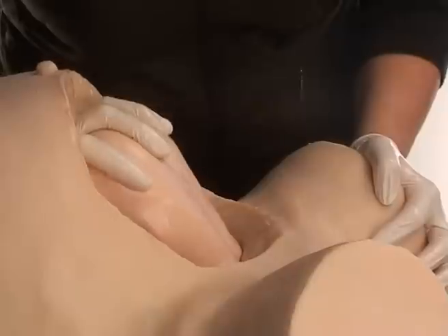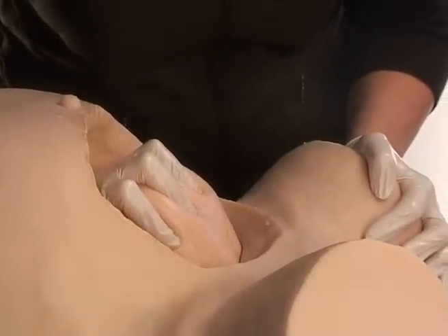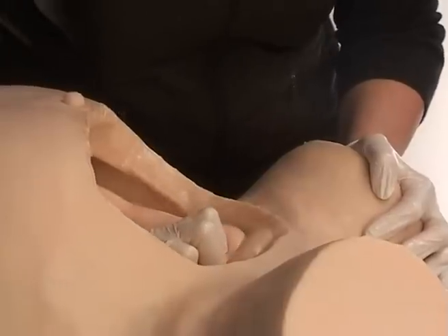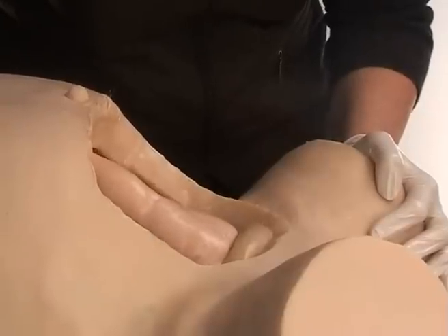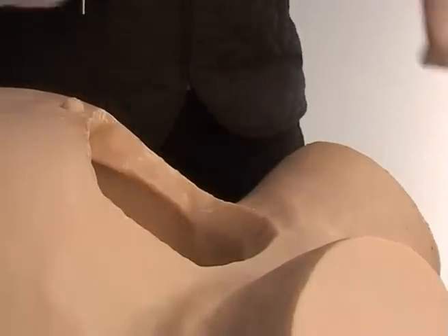Again in a side view, look at how high the buttocks are lifted up and the angle at which Sophie is pushed down into the birth canal. This is the fundamental technique to making the Sophie birth relatively easy. The most common error is to push across towards the vaginal opening rather than down and around the curve of Carus.